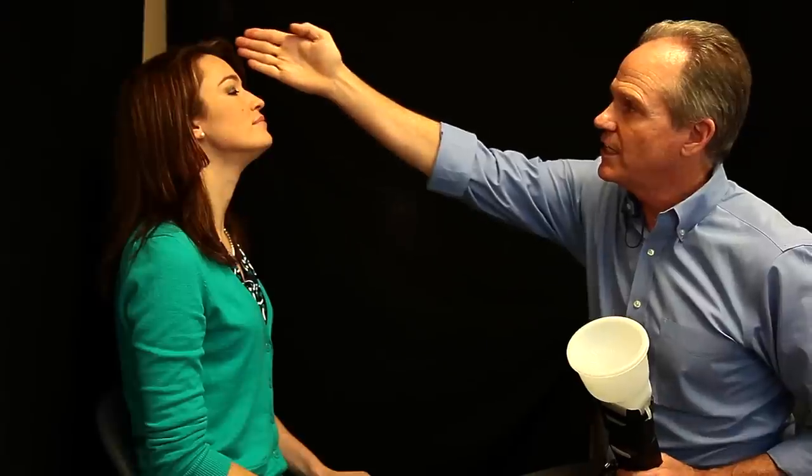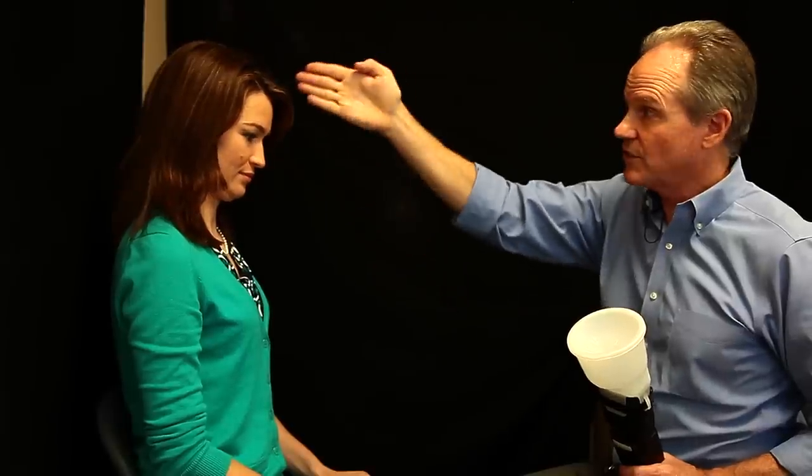You want them to sit up nice and straight and the eyes need to be level with the horizon. If you tip the chin up too much, you can't really see the profile properly; tip it too far in and it changes her facial profile as well. So you want the head up and looking straight into the horizon. Also, large earrings with weight on them will distort the face when you're trying to take pictures — so no earrings, no heavy jewelry, and no glasses.